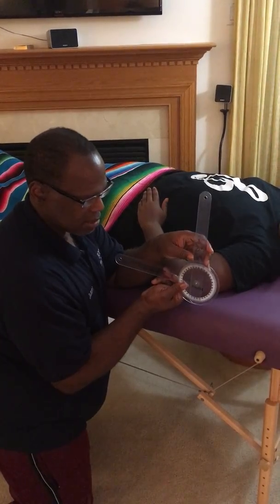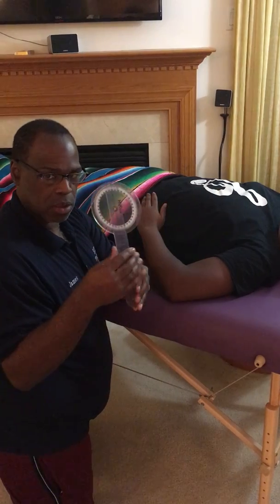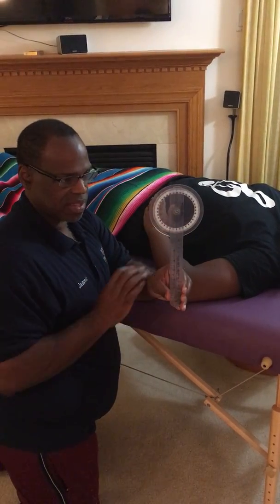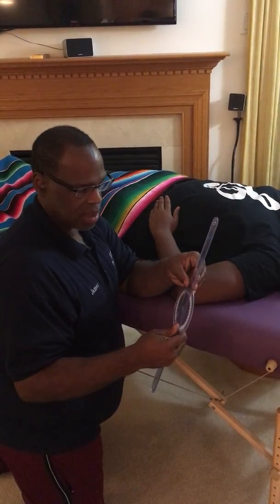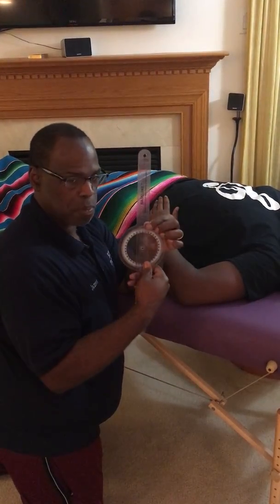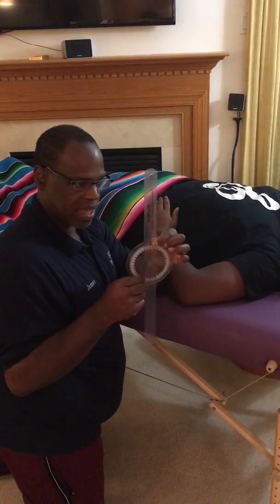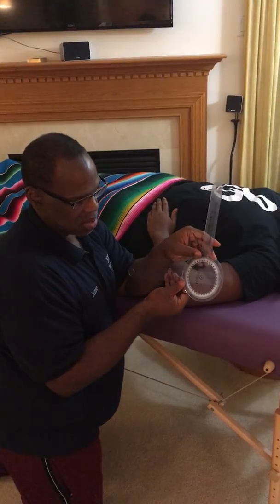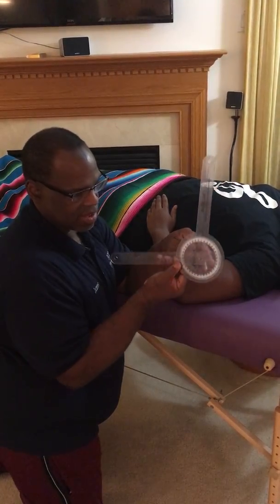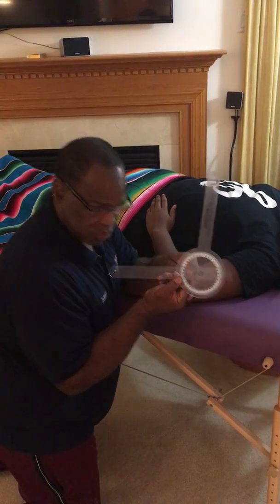So again, some goniometer positions will start with the goniometer in the closed position, noting that this is the neutral position. There are times when the goniometer has to start in the open position, or the 180-degree position, and that will be considered neutral. And then there are times when the goniometer has to start in the 90-degree position, and this will be considered neutral.